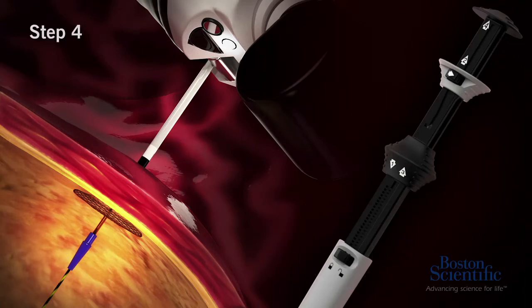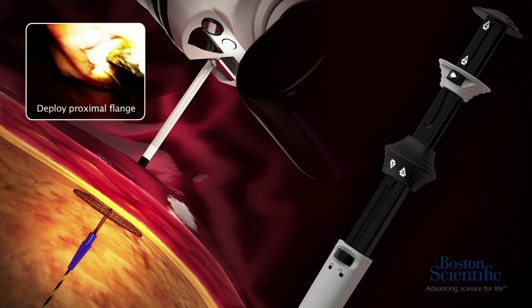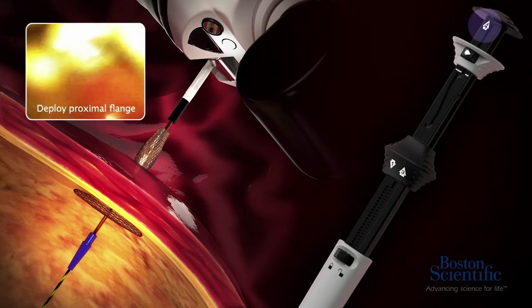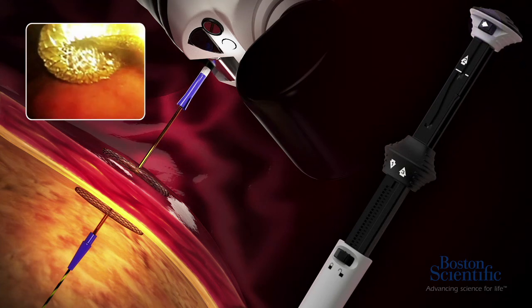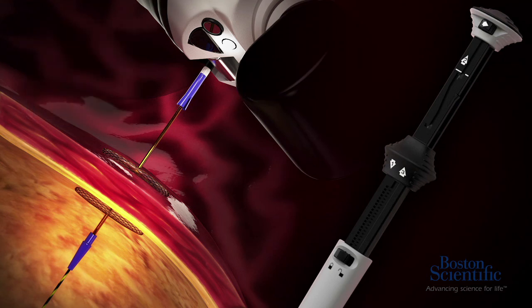Step four. Unlock the stent lock and slide the stent deployment hub upwards towards the number four arrow until the stent deployment hub meets the top of the handle and the proximal anchor of the Axio stent is deployed and visible in the GI tract.